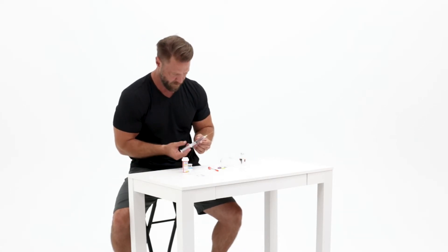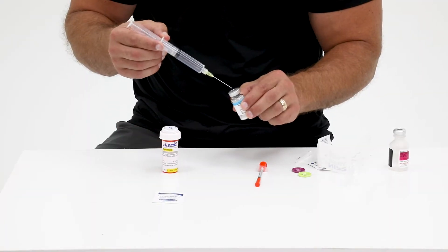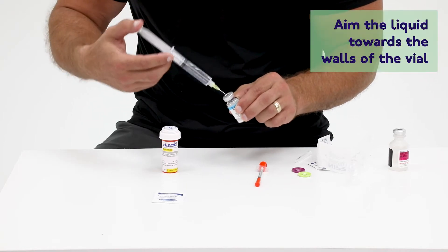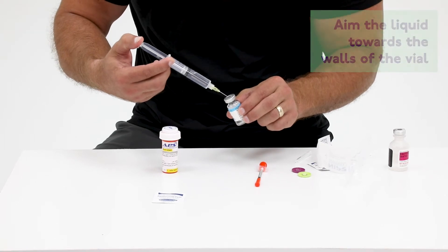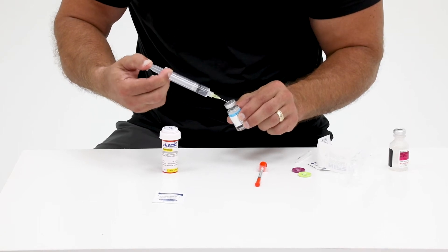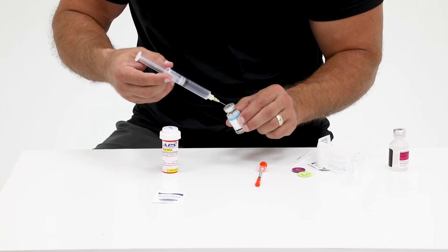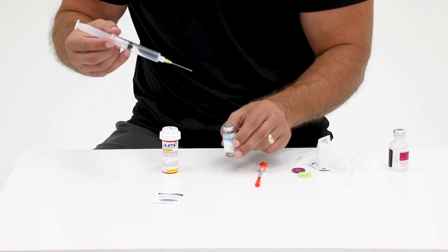Now insert the syringe filled with the bacteriostatic water into the rubber stopper of the lyophilized powdered vial. Hold at a slight angle and slowly press down on the syringe to inject the bacteriostatic water into the vial. Once all of the water has been pushed in, carefully remove the needle from the vial.